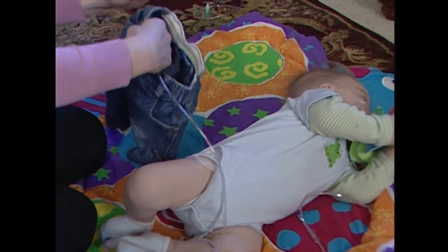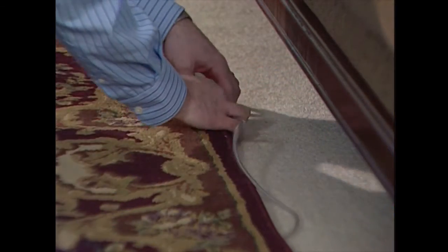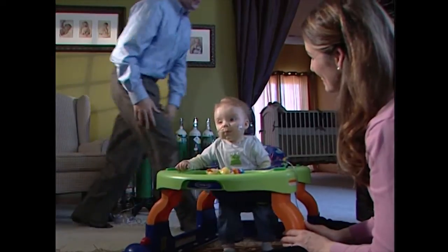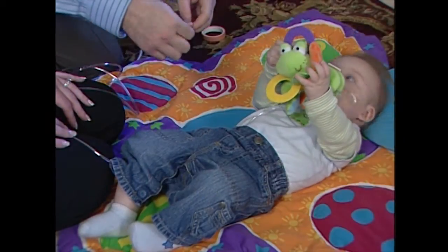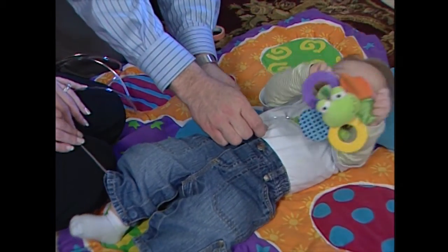Never loop the tubing over the back of your child's head. Your child's safety and comfort is important — always make sure your child cannot trip, fall, or become tangled in their tubing. From time to time, check your child's cannula to make sure it is placed correctly and that the tubing is not kinked, tangled, or twisted.